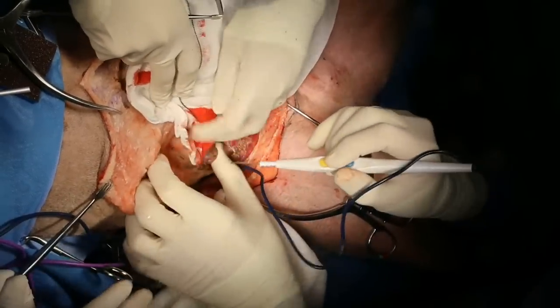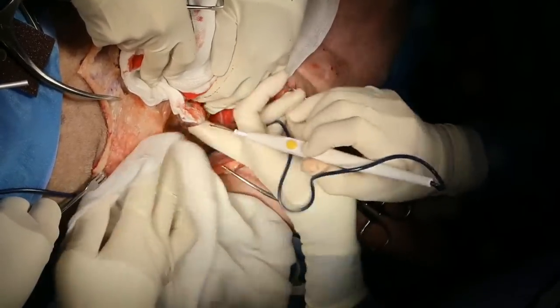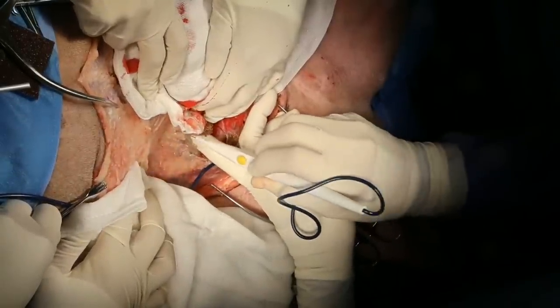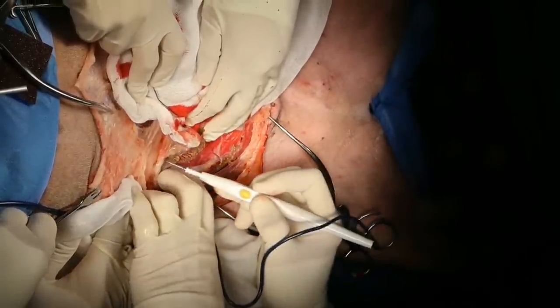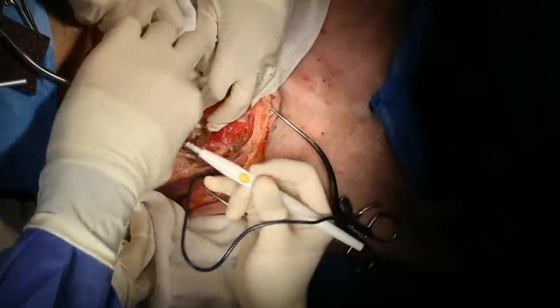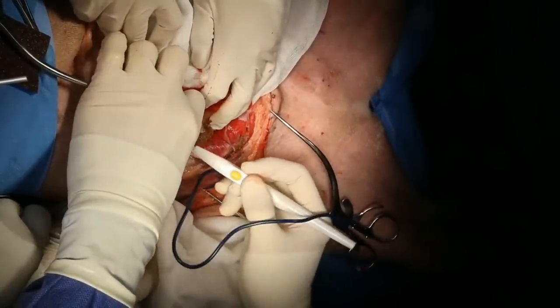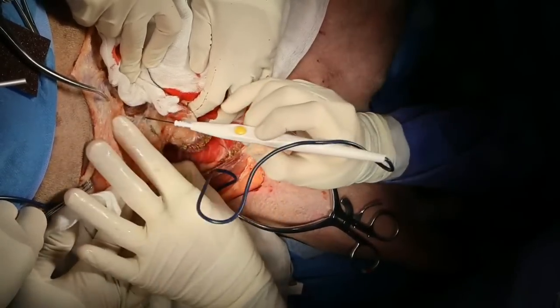Tightly. And you won't shock your finger. You might burn your finger, but you won't shock it as long as there's no hole in the rubber. But if there is, you'll know it. Have you two that are scrubbed in with me ever been shocked by cautery? No. It really hurts.